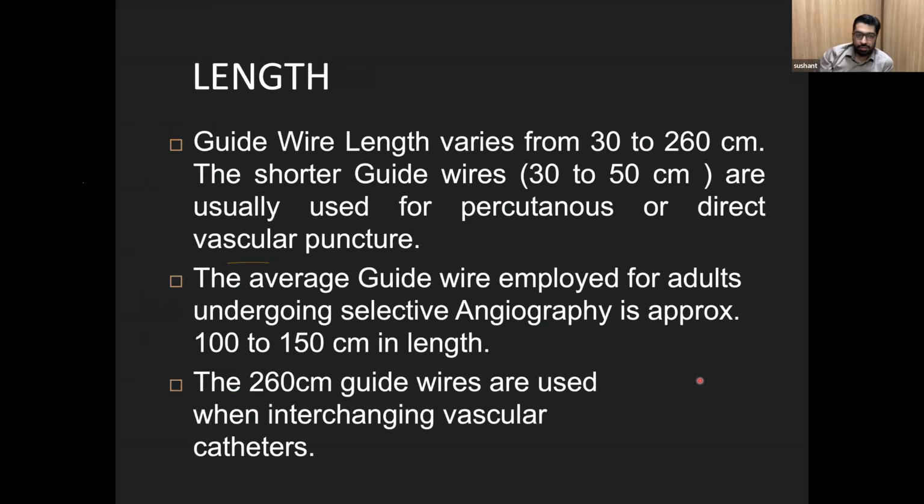And length of the guide wire. These are available according to our need. If we want to go very distal, we are taking a femoral access and want to reach the brain, then we need larger guide wires, larger catheters. So these guide wires are available in various sizes.